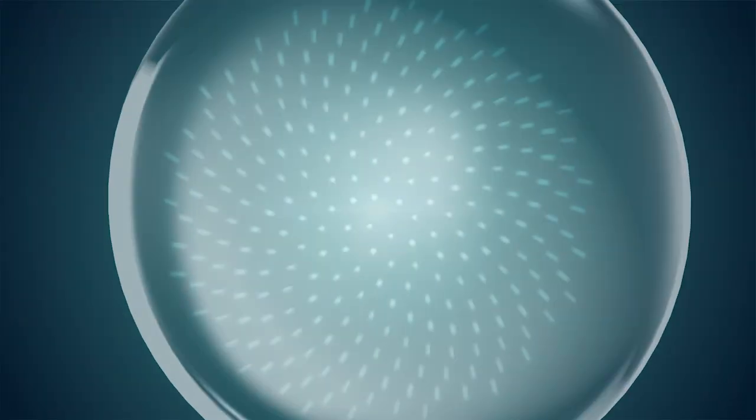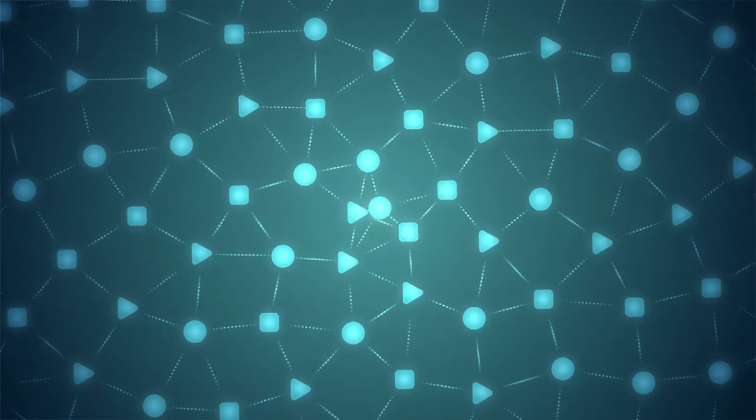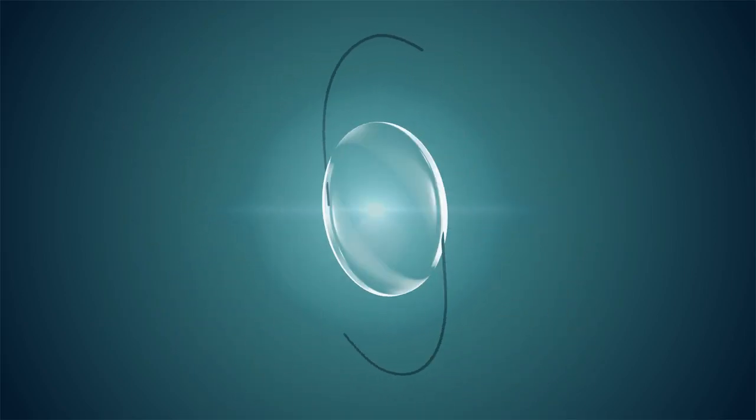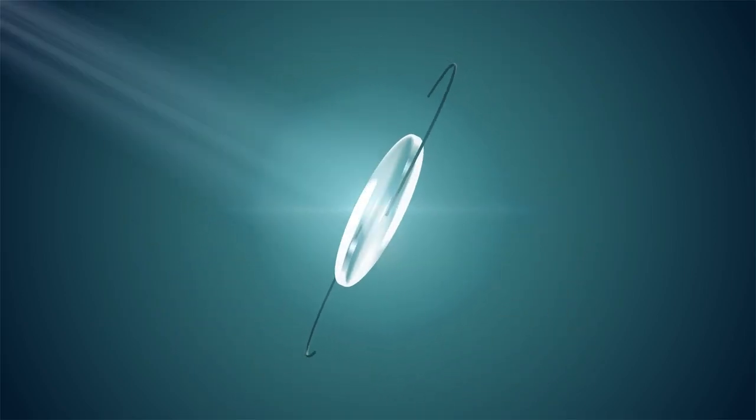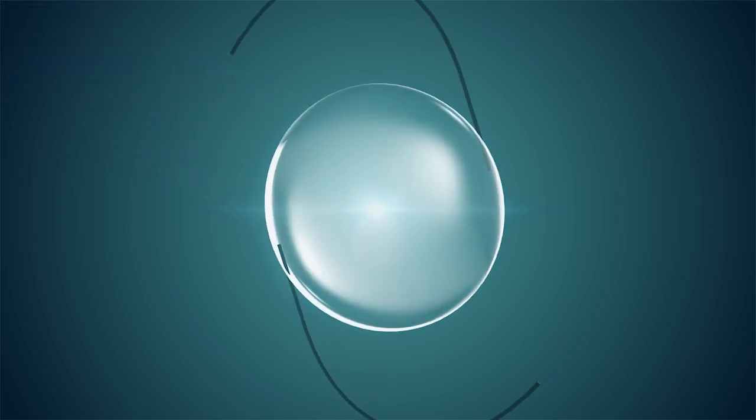The light adjustable lens contains light-sensitive molecules and uses photochemistry and diffusion to achieve adjustability. A calculated beam of UV light from a patented light delivery device is directed at the lens to precisely change the lens's shape and focus based on the patient's desired refraction.